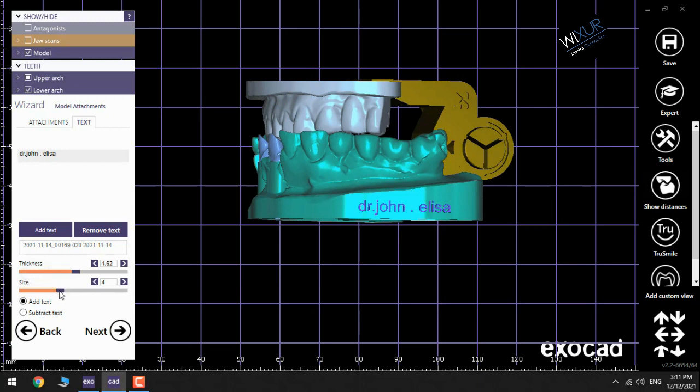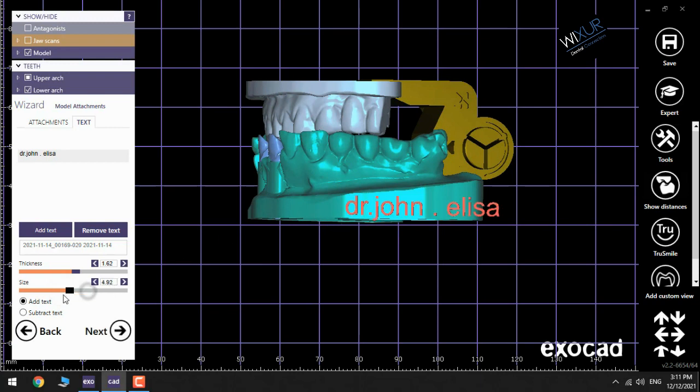Change the numbers for bigger, smaller, thicker, or thinner text.